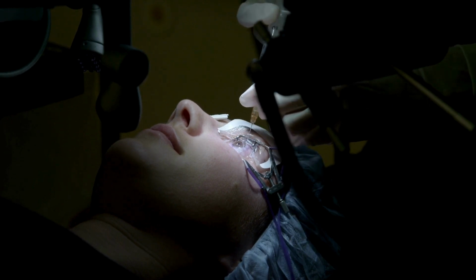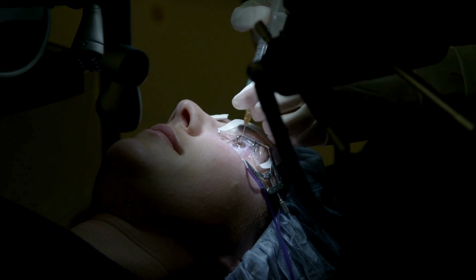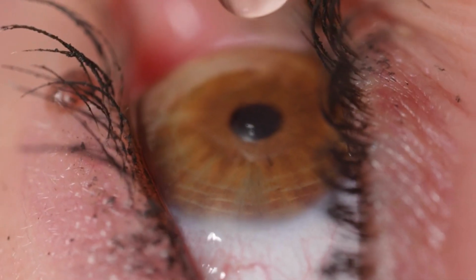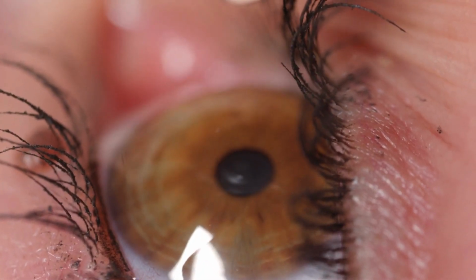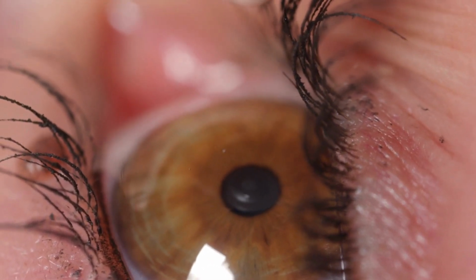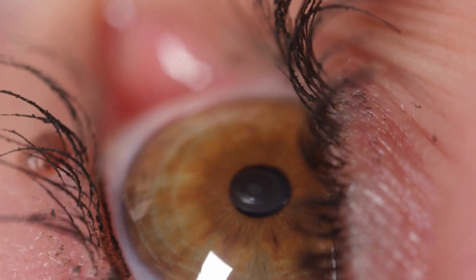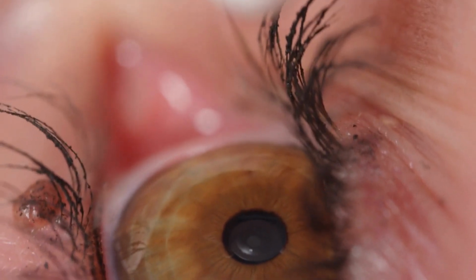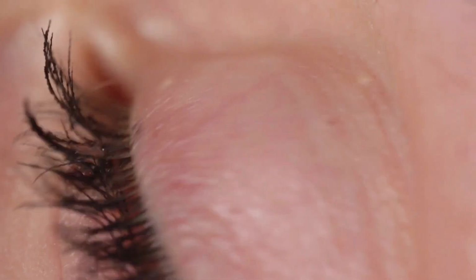Cataract surgery planning. Keratometry provides information for selecting an intraocular lens. Tomography-based corneal topography can evaluate corneal curvature more thoroughly with higher precision, yielding information on corneal astigmatism that helps guide the accurate selection of the toric intraocular lens model and improve postoperative outcomes. Tomography-based corneal topography can identify cataract patients who previously had LASIK/PRK. It is crucial to select appropriate vision correction methods.